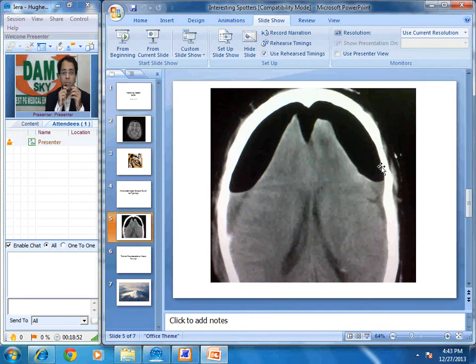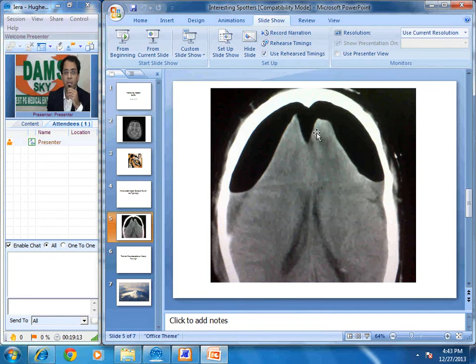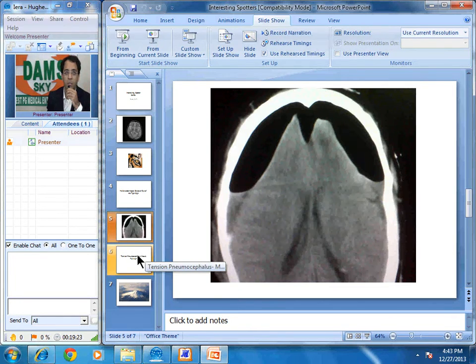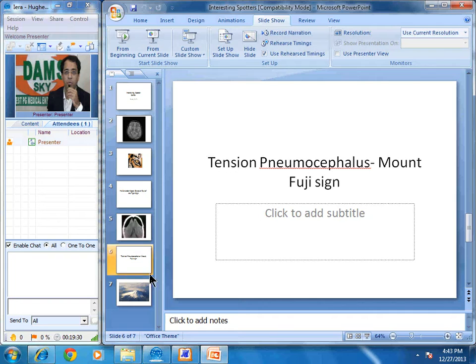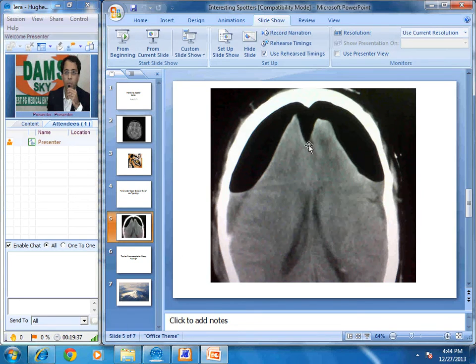Sometimes it is a diagnostic dilemma to differentiate between tension pneumocephalus, where surgical intervention is required, from non-tension pneumocephalus. A very interesting sign has been described: the air is tracking into the interhemispheric fissure and the two hemispheres are separated by this air. This has been described by many authors as the Mount Fuji sign — named after Mount Fuji, a mountain with two peaks. This sign indicates tension pneumocephalus.